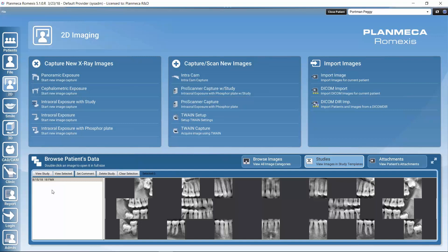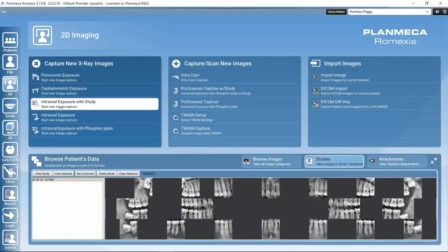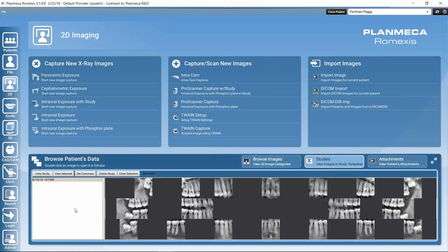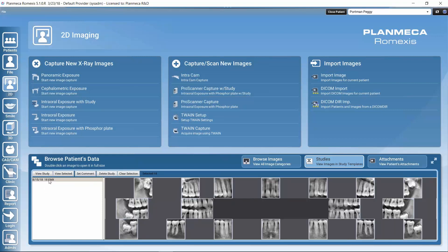How we can actually make the studies — we can capture, for example, intraoral images directly into the study. Or, we may have already taken the images and want to build the study afterwards. Let's take a look at this one study that we already have here. If we had several studies on the list, we could select a study by clicking on it.